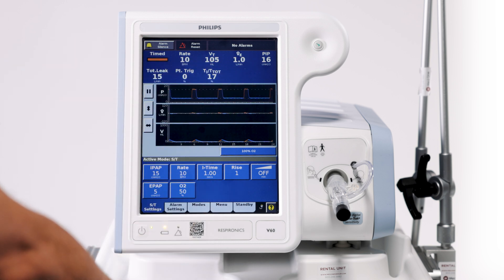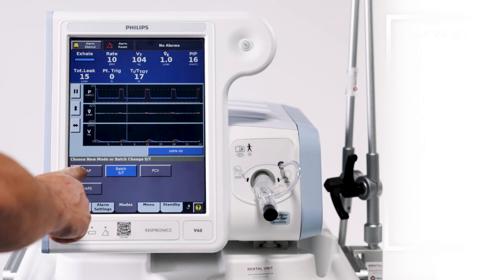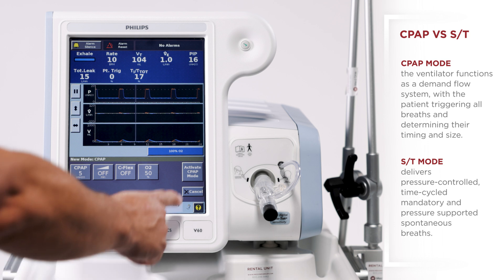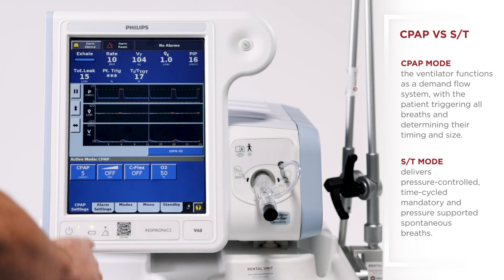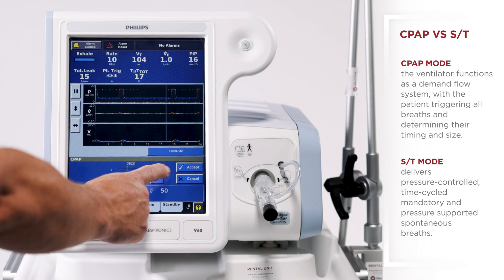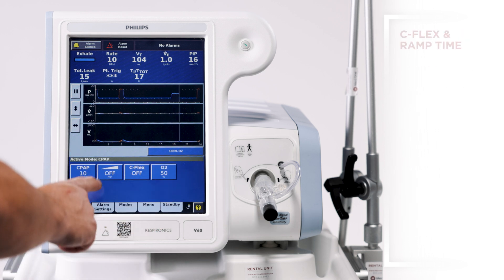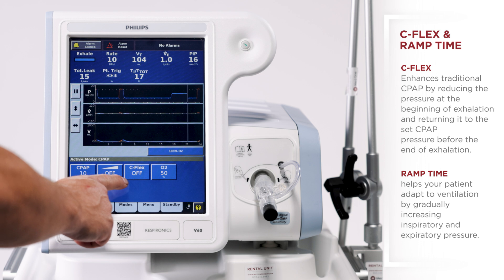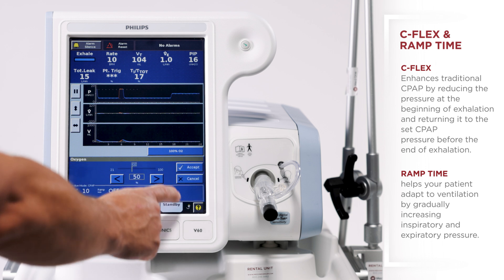From here we can switch the ventilator into a different modality. To do that we're going to go down to our modes. We're going to put it in CPAP mode and activate the new CPAP mode. From here we're going to set a CPAP of 10. We're going to leave the C-Flex and the ramp off and we're going to have an FiO2 at 30%.